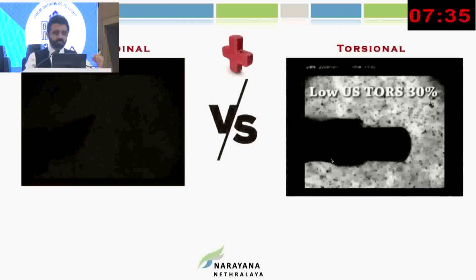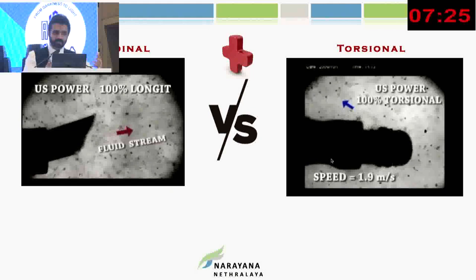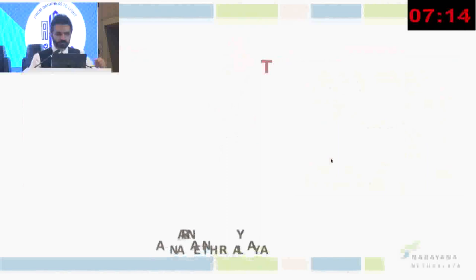But when you look at the longitudinal power, let's say if it is at 100%, if you look at the particles in front of the phaco tip, they are pushing away from the tip. So this is what I'm sure each one of you have realized: when you put excessive longitudinal power, the pieces go away from the tip, which is counterproductive to what you're actually doing.